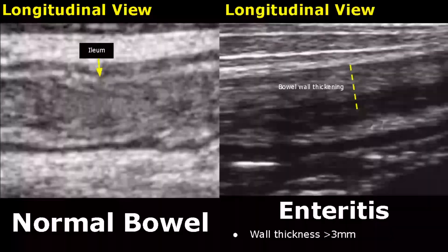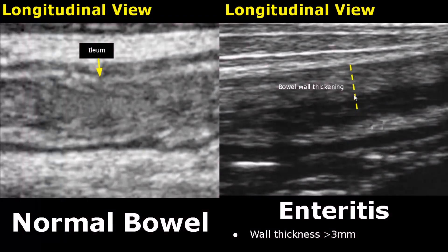Enteritis is an infection of the small bowel. On ultrasound, the bowel wall thickness will be increased due to inflammation — it will be greater than three millimeters.